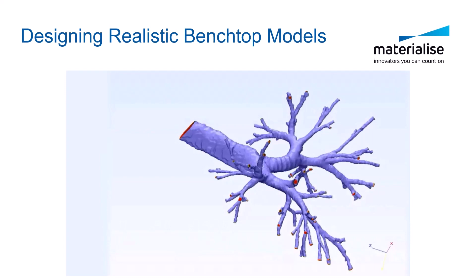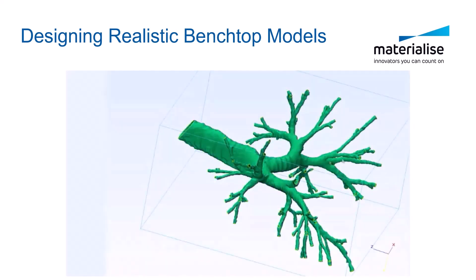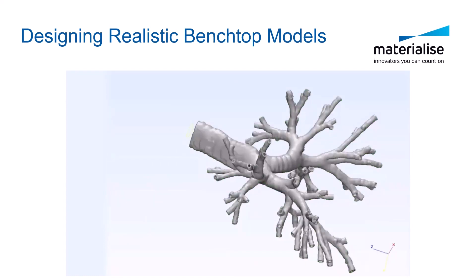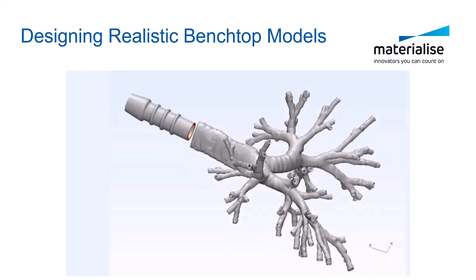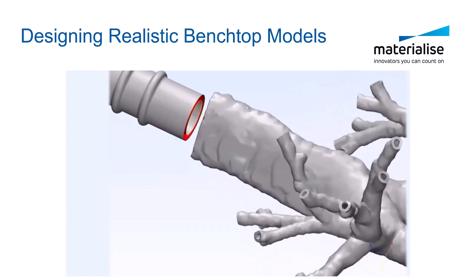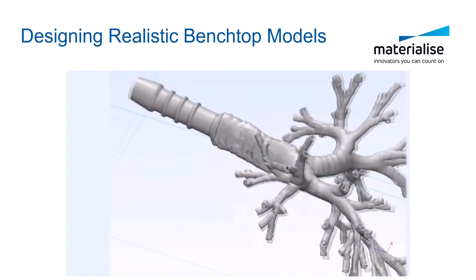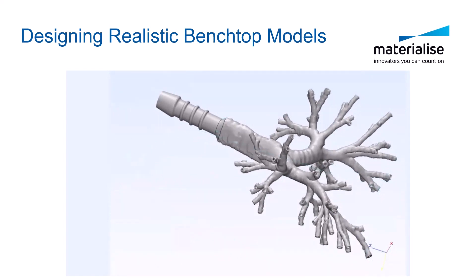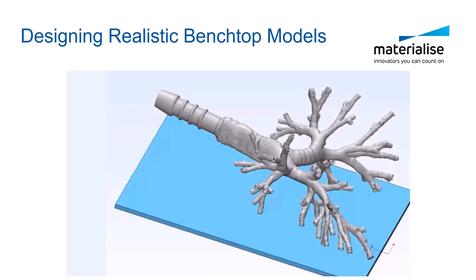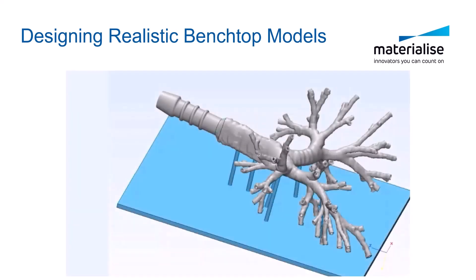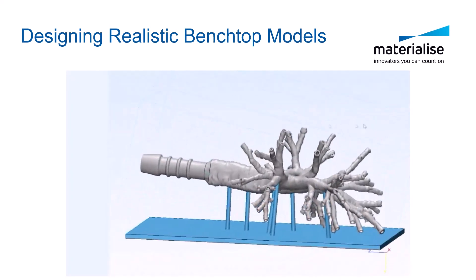Create a hollowed version of the solid airway model. Attach connectors by importing connector STLs and fine-tuning the transition between the two. Design a base plate and auto-create the supporting beams to support that model on the plate. And finally, export the benchtop model for 3D printing.